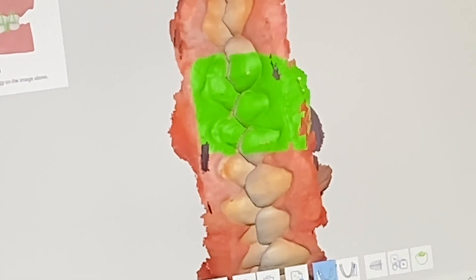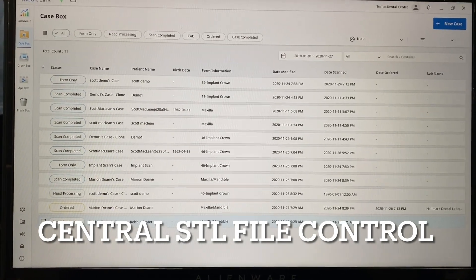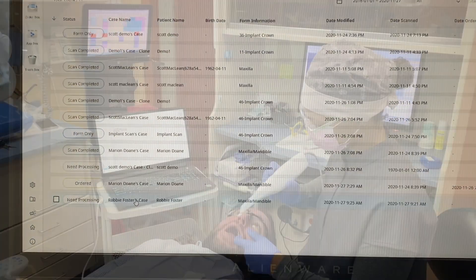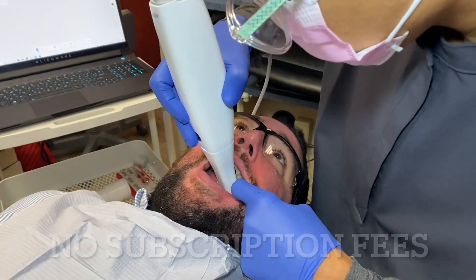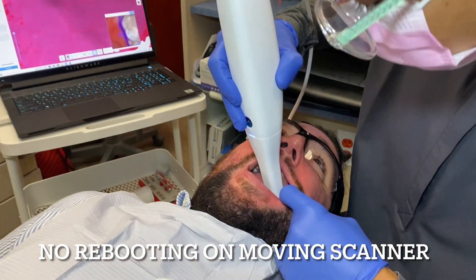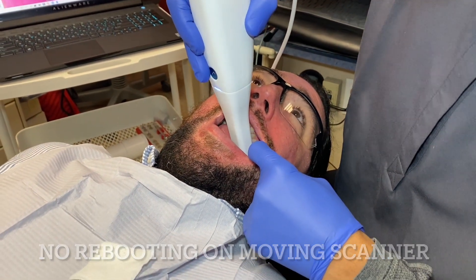The neat thing about these STL files is you can take them and send them to the lab, to your consult room, to wherever you want — even to the patient. It's very, very easy, and this is one of my favorite features of this scanner. Last, this scanner does not have subscription fees. And one of my favorite features is you do not have to reboot it — you unplug it and the battery power of the laptop keeps it going, and we also have a battery supply plugged in.